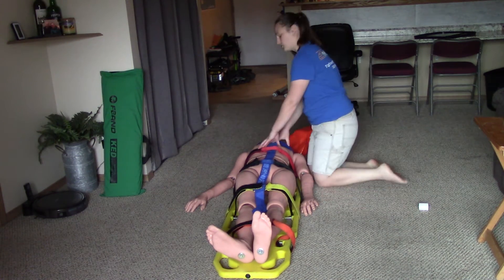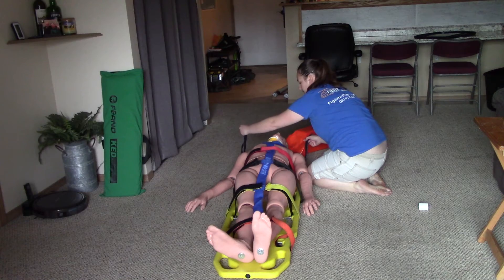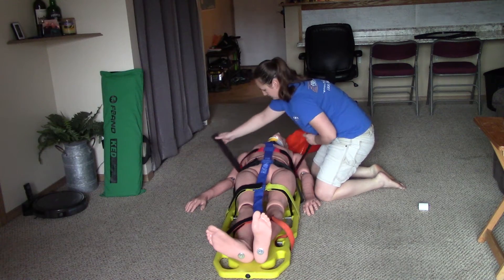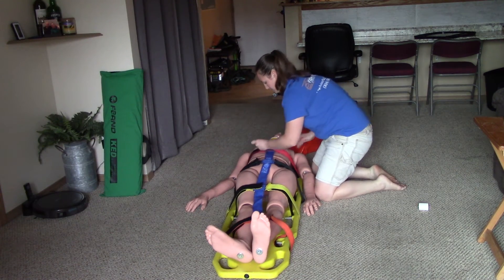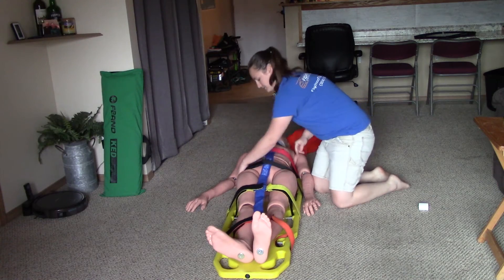When I do these two top straps, I need my patient to take a breath so I can make sure their breathing is not impeded. I'm going to get these unhooked and tighten both at one time. Take a deep breath and hold it — exhale. Take a deep breath and hold it — okay, you can relax, breathe as normal. Tightening both sides.